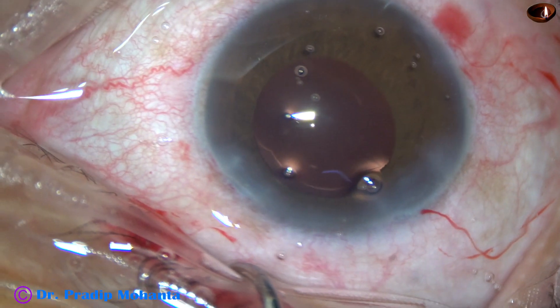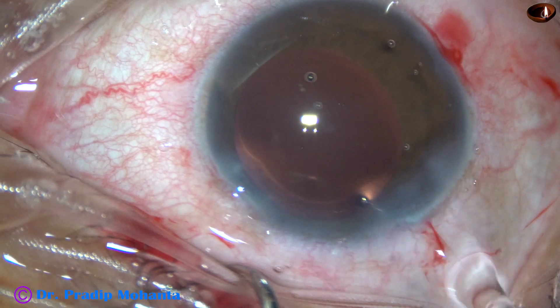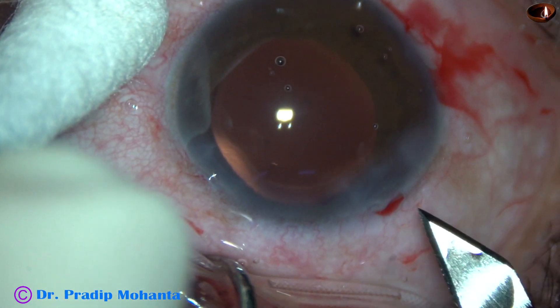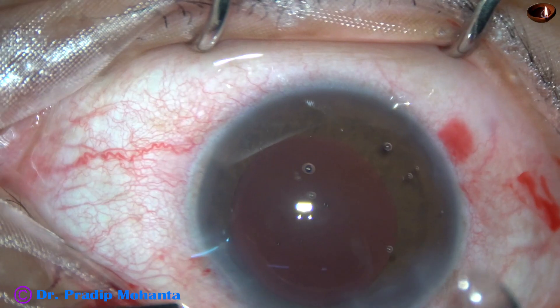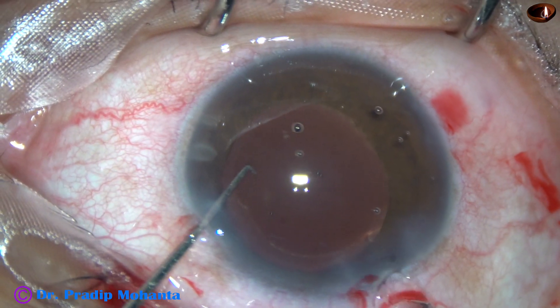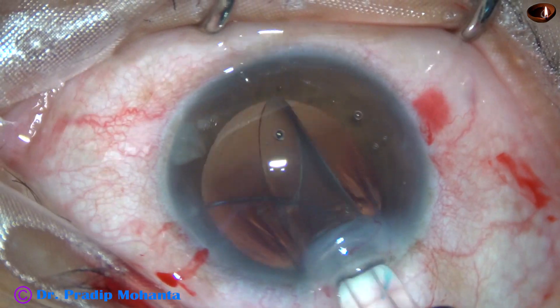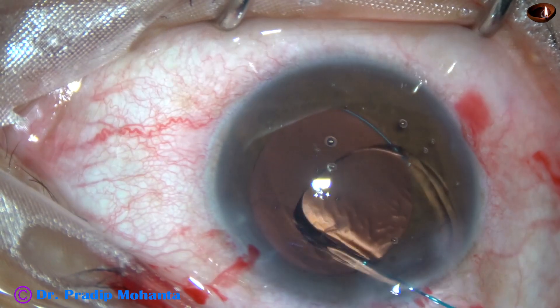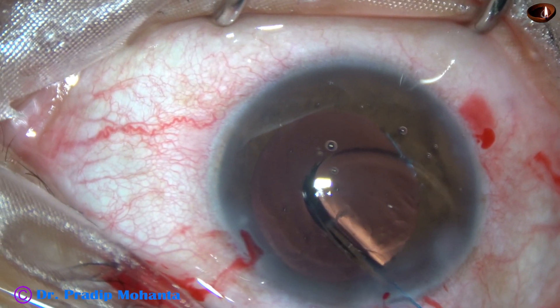In this case, the IOL power is minus 2 diopters. The actual axial length is 31 millimeters and the keratometry readings are 42 and 43. I enlarged the main wound a little bit so the cartridge goes inside. In high myopes, I always implant a multipiece intraocular lens from Johnson & Johnson. The overall diameter of this lens is about 13 millimeters.